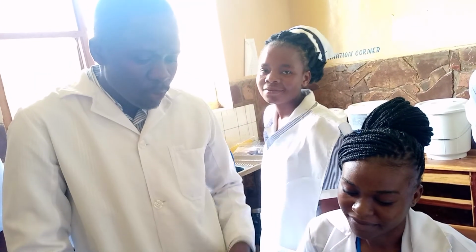You're okay. And for the fever that you complain about, we'll try other tests. So you can send the patient to do other tests, or if you are doubting this, you can try to do a blood slide and also try to do other investigations for things that cause fever. If it's flu, you can also investigate to find out, or maybe during your history taking, you can discover that it's a flu. So you can just give treatment accordingly. So at this moment, since it's negative, you proceed to do other investigations.